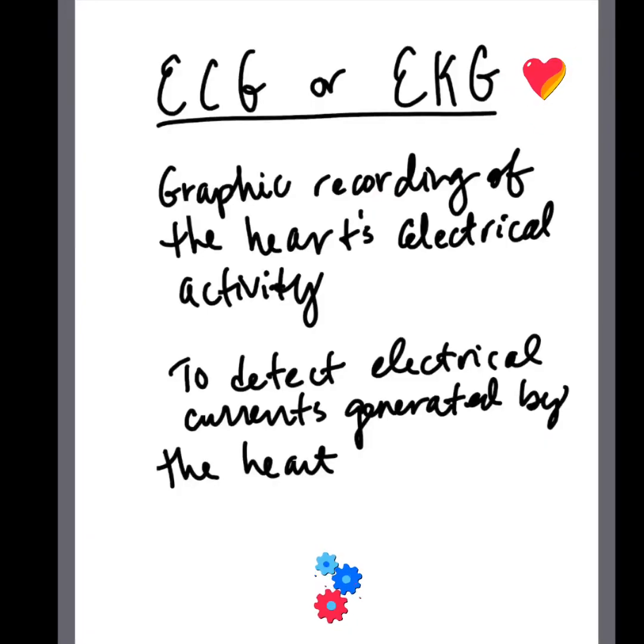In this video, let's talk about the electrocardiogram, also known as ECG or EKG. So the first thing is that the electrocardiogram can detect electrical currents generated by the heart. It's basically a graphic recording of the electrical activity, and it's a composite of all action potentials at a given time. So it's not a tracing of a single action potential. It's of all the action potentials.